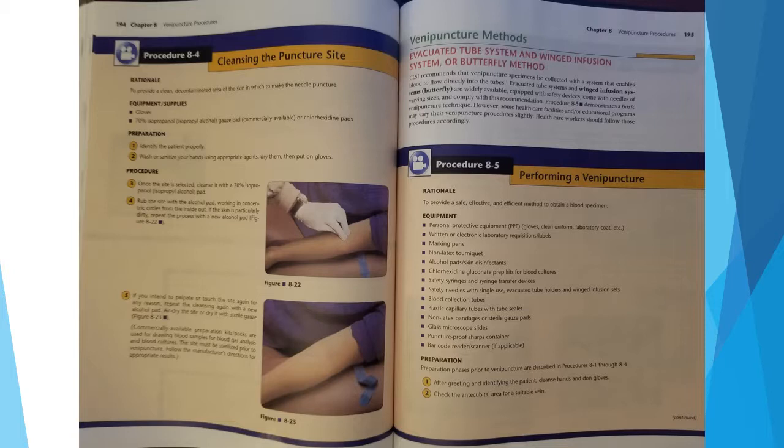Procedure 8.5 demonstrates a basic venipuncture technique. However, some healthcare facilities and/or educational programs may vary their venipuncture procedures slightly. Healthcare workers should follow those procedures accordingly. Page 194 shows procedure 8.4, cleaning the puncture site. Page 195 shows procedure 8.5, performing a venipuncture.